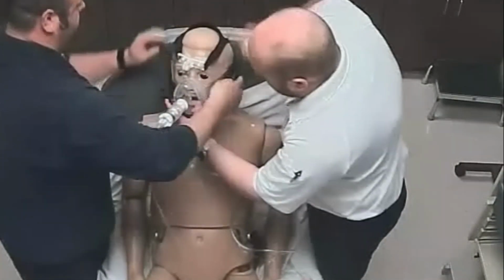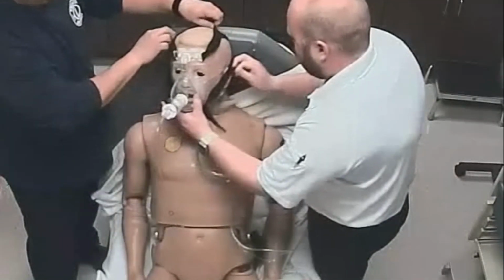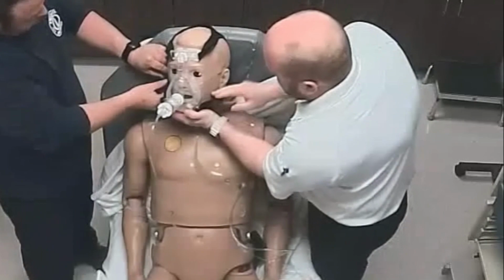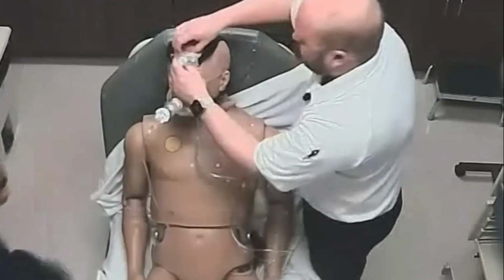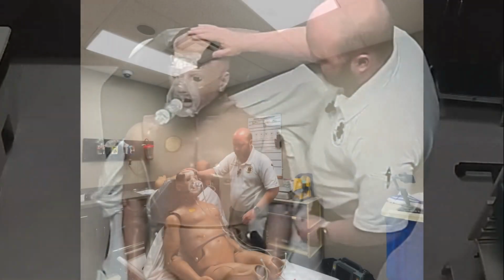Go ahead and tighten your bottom strap. And then tighten your top strap. Make sure that is snug up against the patient's forehead and adjust as necessary, and tighten this as necessary.